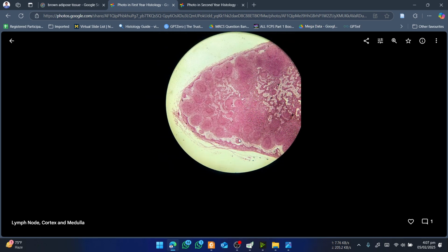Lymph node is a whole organ, it contains lymphoid nodules. And here I have seen students make that mistake again and again, that they consider lymph nodules and lymph node one and the same thing, that leads them to misidentify the tissues. So these are lymph node, and you will see different pictures of lymph node.